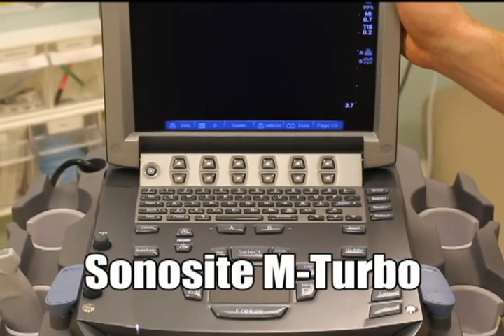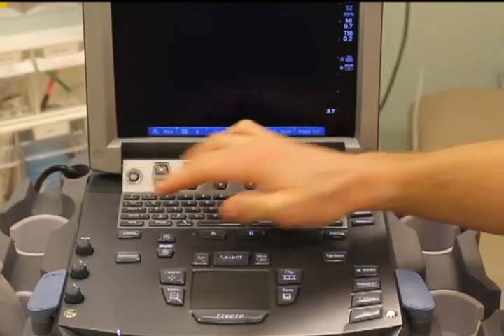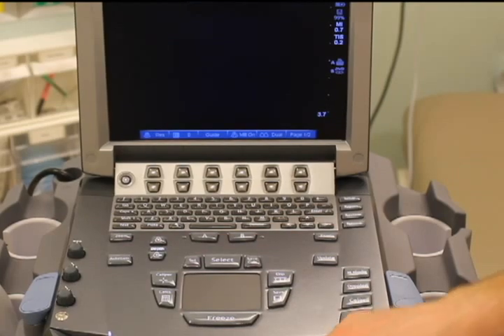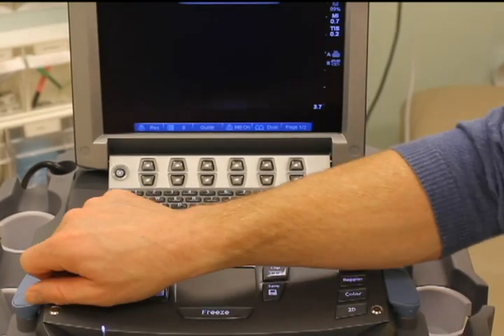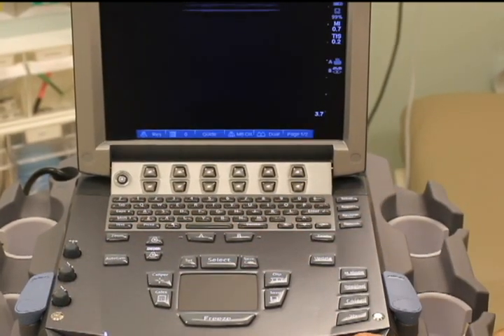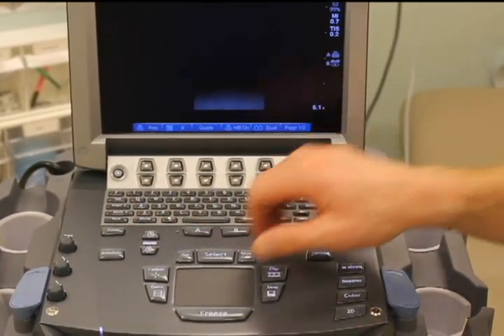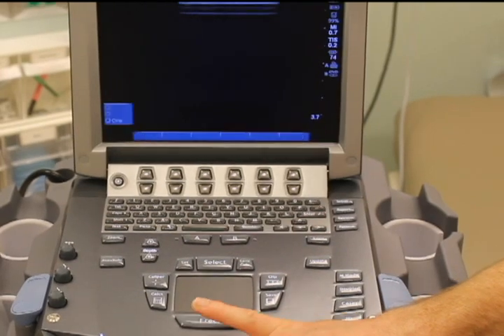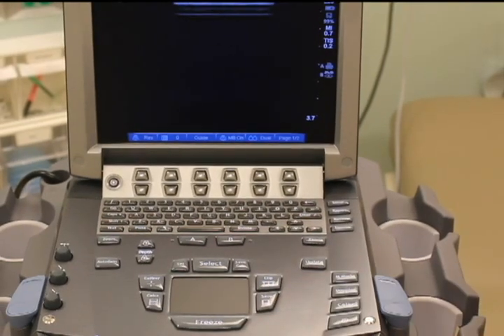Onto the M-Turbo — this is the machine you'll find in the ICU and ER here at Stanford. The on/off button is right here, and it opens like a laptop. To review the same buttons as the Model S: there's an auto gain button here and a manual gain control in the corner — turning it up increases the signal, and down gives less signal. For depth, instead of a dial, you have buttons: press down for greater depth, and the other button reduces it. There's a large freeze button — press it to freeze, press again to resume. And here is the save button in the corner, clearly marked.